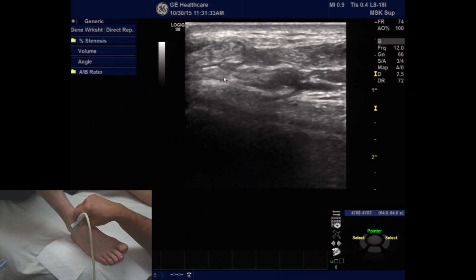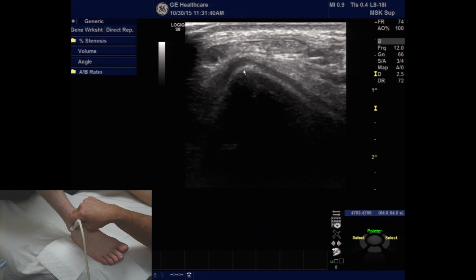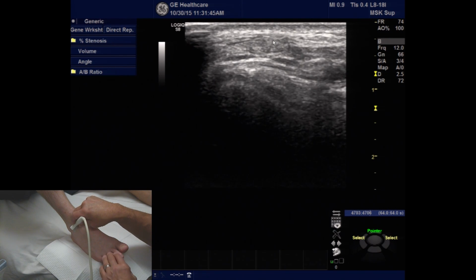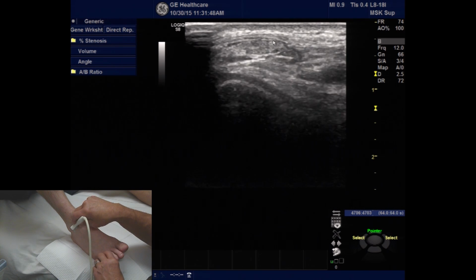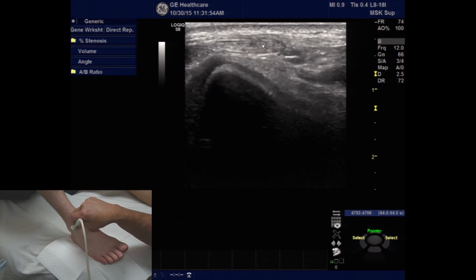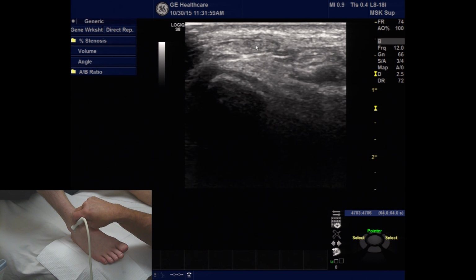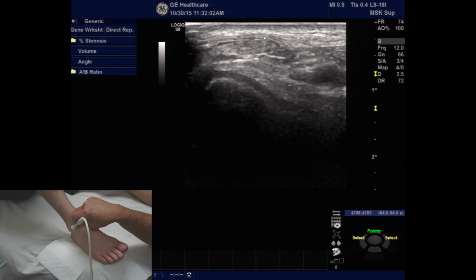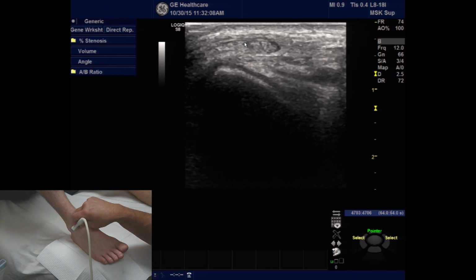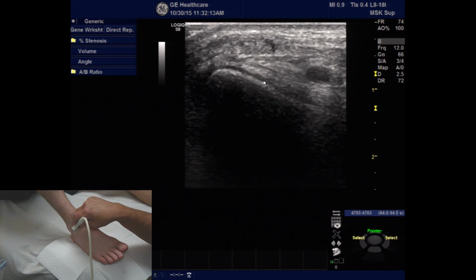Continuing to move in the lateral position, we're going to go over the lateral aspect of the tibia until we see the tendon structure in short axis of the digitorum. As we move the individual toes, we can see the movement in short axis of the extensor digitorum. Once again, looking just superficial to that structure, you're going to see the fibers of the extensor retinaculum. Going just a little bit deep, we're going to see the talus again and the articular cartilage sitting on top of the talus.